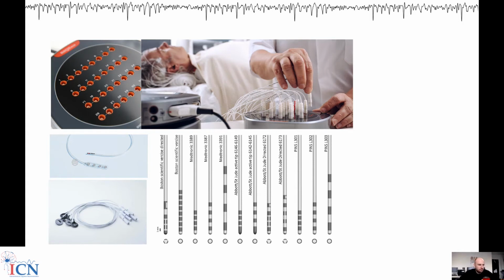Yeah, so we also tried to see whether we find a distribution of beta activity for the different contacts. And our conclusion so far is that if you stay on one height, it is not really clearly distinguishable.